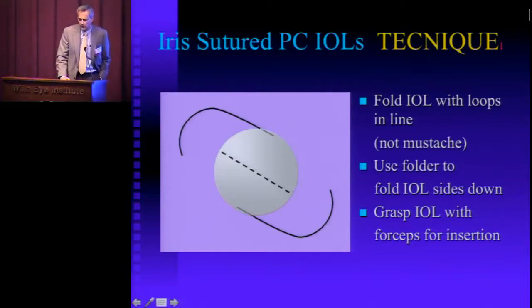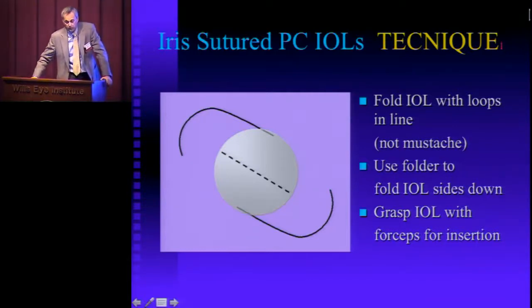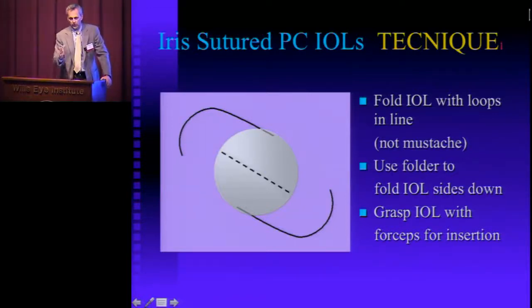The most common indication, I think, for needing a lens implant when you have no capsule is when you have unplanned loss of the posterior capsule at the time of cataract surgery. Frequently, this is with a small incision surgery, and we still keep some of the Prolene loop posterior chamber lenses over in a small corner. I have no proprietary interest in any of the lenses that you may or might not use, but an acrylic lens with PMMA loops is helpful because here's the way that you can get a posterior chamber lens in when you lose all the capsule at the time of cataract surgery.